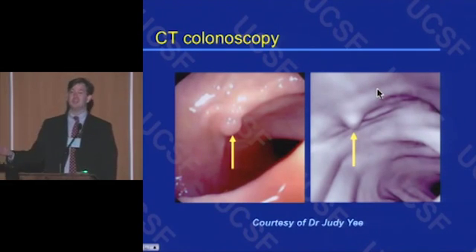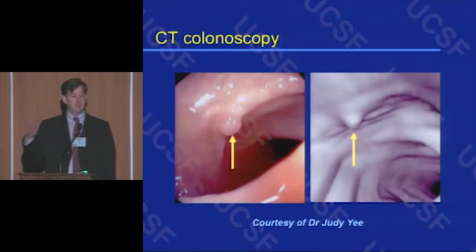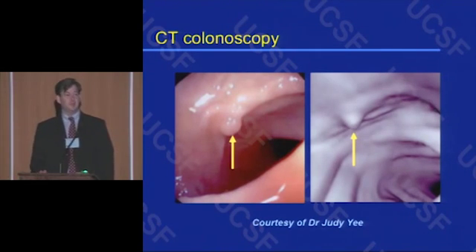People don't realize when they order the double contrast that this involves gymnastics. People are moving up and down, head up. For the CT colon, you just lay on your back, lay on your stomach, you're done. So it's actually much more tolerated than the double contrast barium enema.